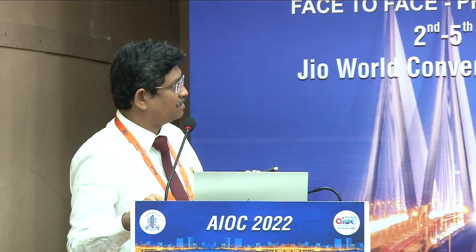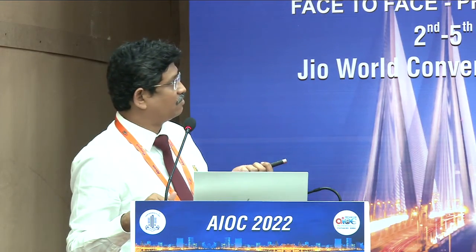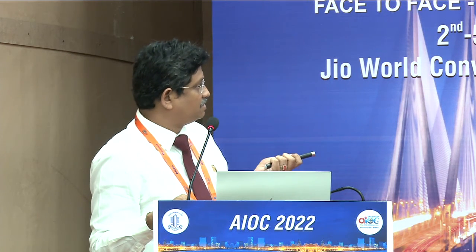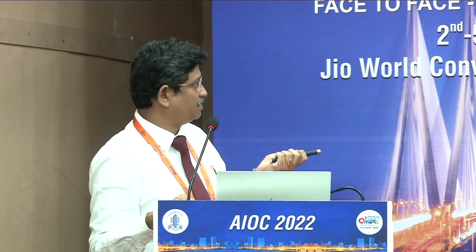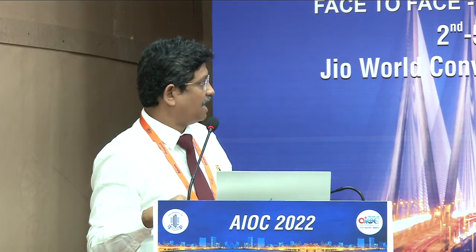So we thought, why not put, instead of the ILM itself, since ILM cannot regenerate the retina at that area, the retina per se into that hole and see what happens. For that we devised a kind of retinal trephine. Preoperatively we measured the size of the failed macular hole, predetermined the size, and harvested an autologous retinal graft just above the arcade, and freed it with the help of a forceps and scissors. This part is done under saline, and then you do the fluid-air exchange.